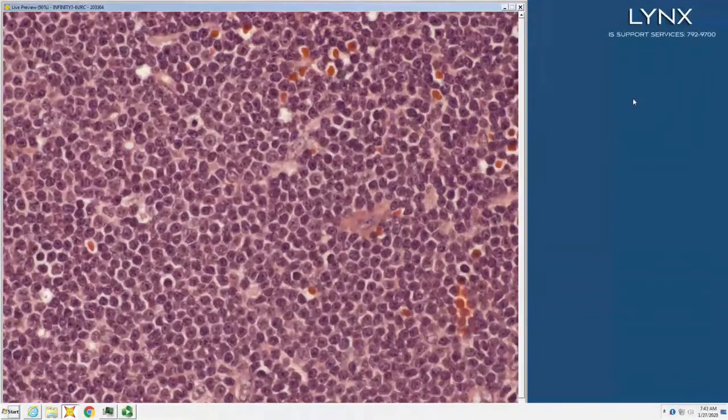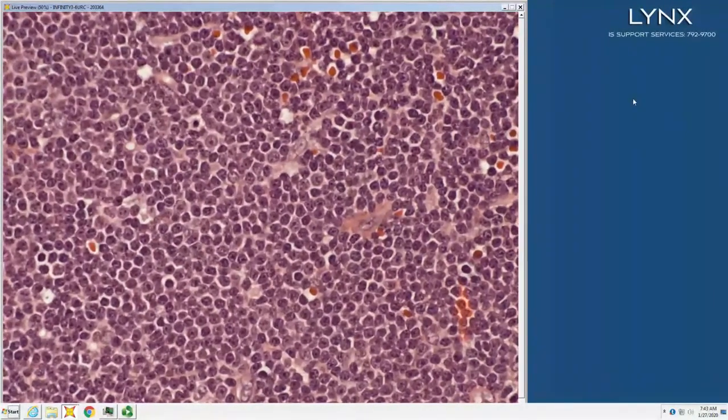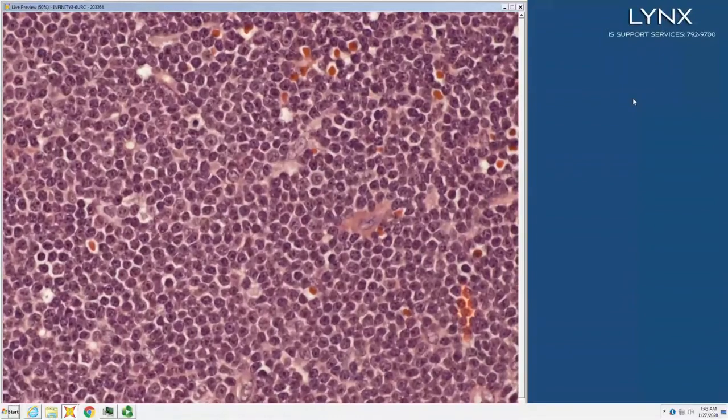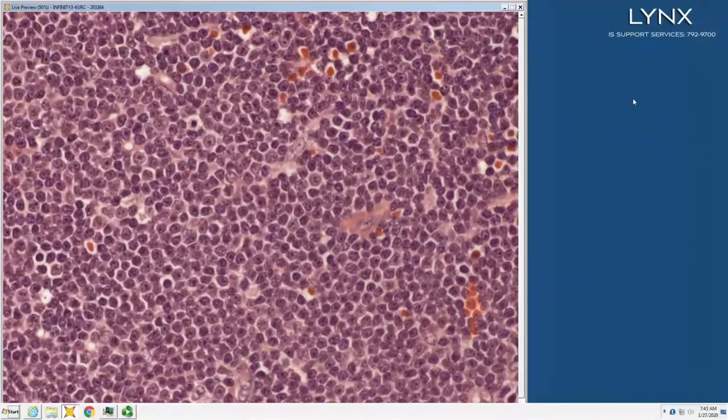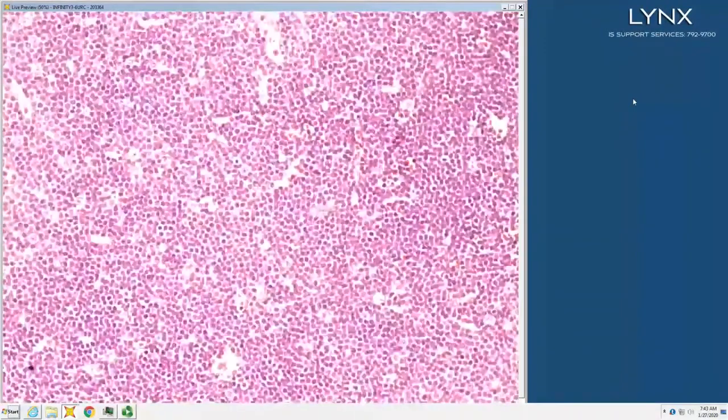They're not round, right? Sometimes you don't see a deep cleft, but you see that the cell is not round. It's got a kidney bean shape or something where it's trying to cleave. A lot of the nucleoli are peripheral as well as some central ones, so you have centrocytes and centroblasts in this lymphoma.